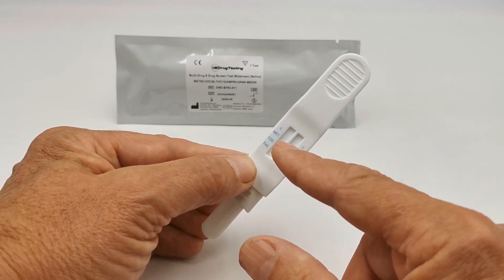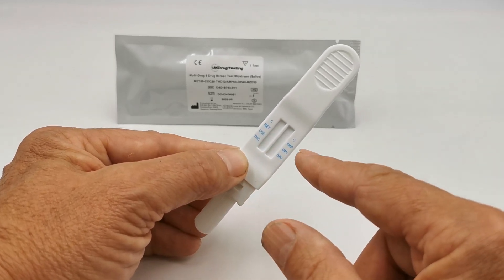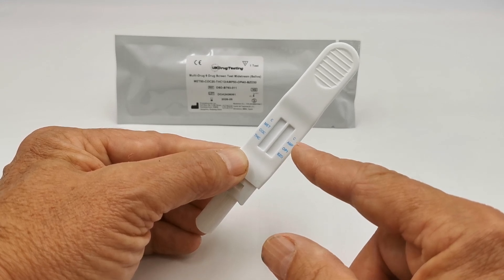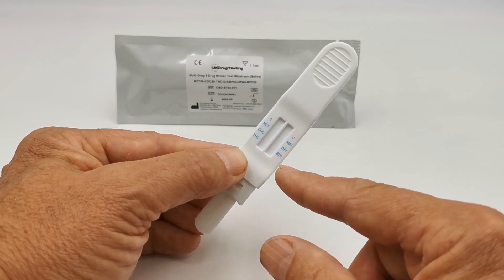The left-hand column screens for methamphetamine, cocaine, and cannabis. The right-hand column gives you a control line and test lines for amphetamine, opiates, and benzos.